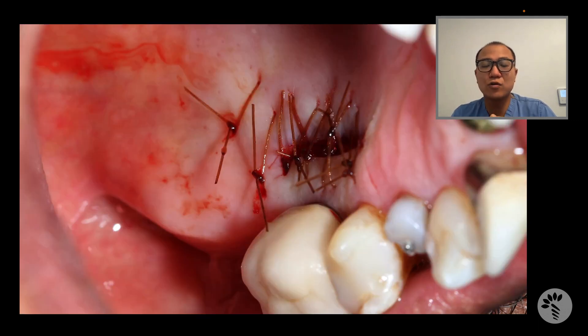This is how we look at the donor site, where I made an incision on the palate, went into the inside layer of the palatal epithelium, and took the connective tissue graft.